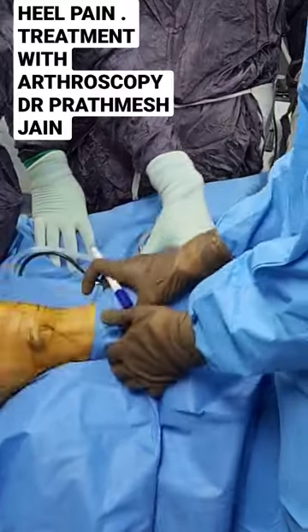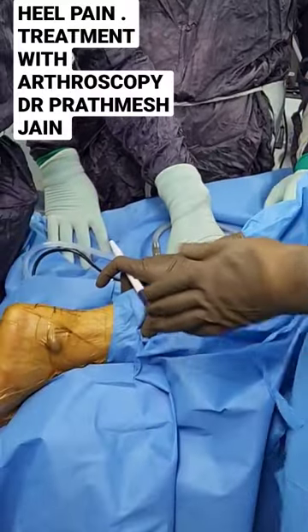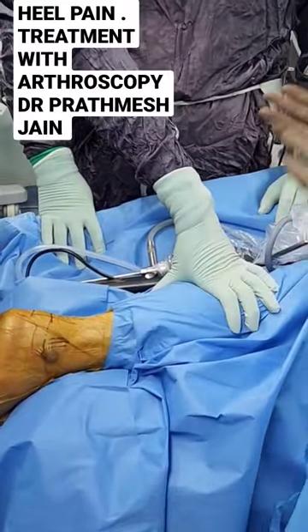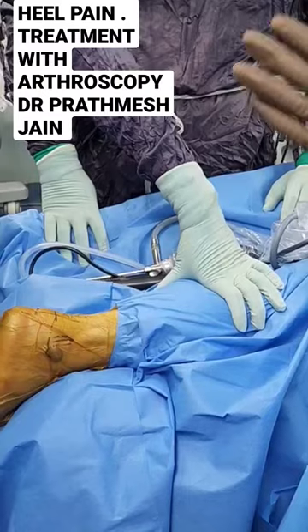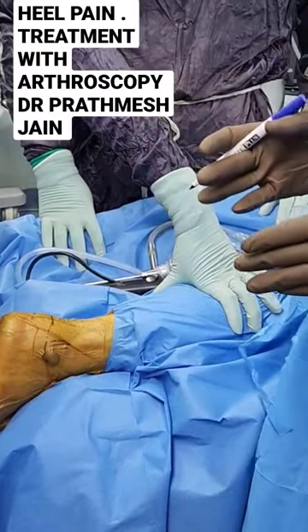If you want, we can just do a flexion-extension at the knee to confirm that the movement is free, and we want to ensure that the patient is stable in this position.